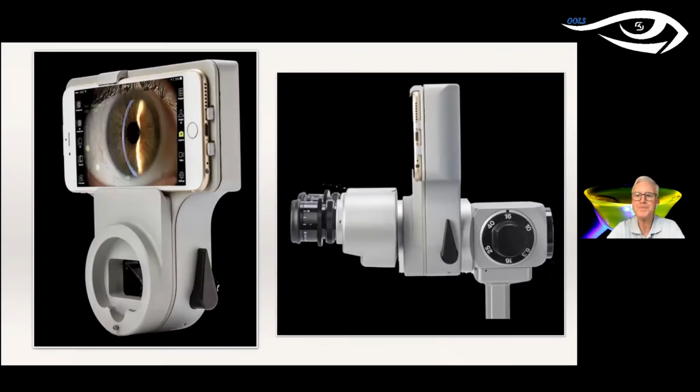Now, this is a little unit we saw just a few slides ago, and it's a very, very interesting device. It fits, as you see, in between the objective and the oculars of the slit lamp. Most slit lamps have a little connection there that allows you to detach the oculars from the objective magnifying lenses. And in that space, you place this little unit, and the little black lever that you see flips the image between the oculars and the little iPhone that you see there.